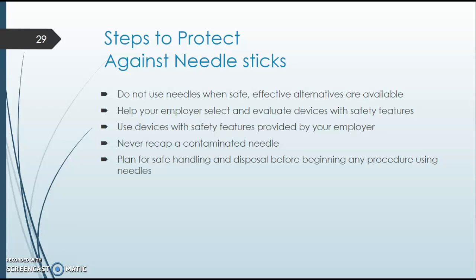There's risk for poking yourself. So when you put a cap over a needle, you're using 2 hands. And again, we want to use 1 hand with the needle at all times. That way there's less risk for injury.